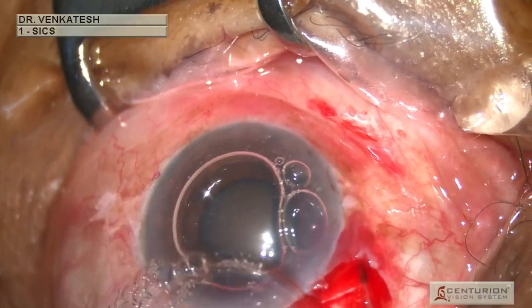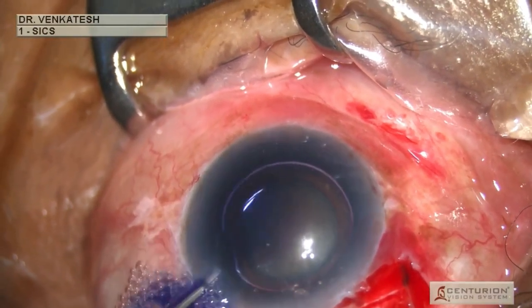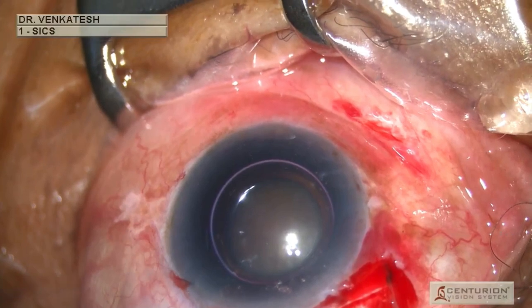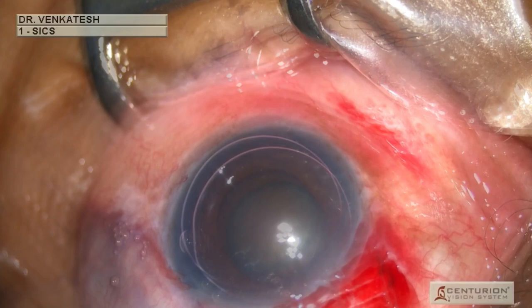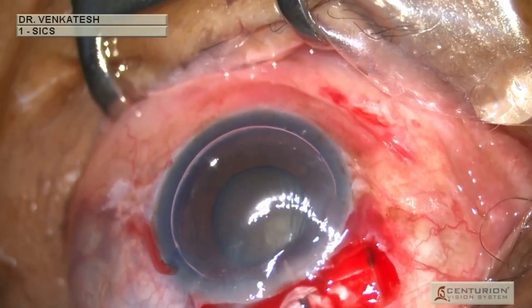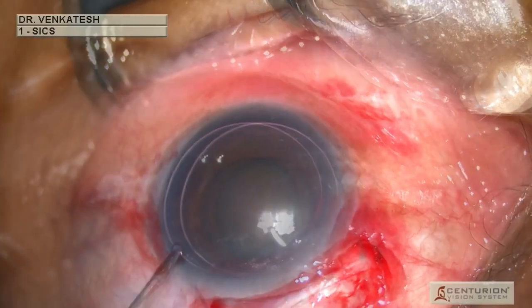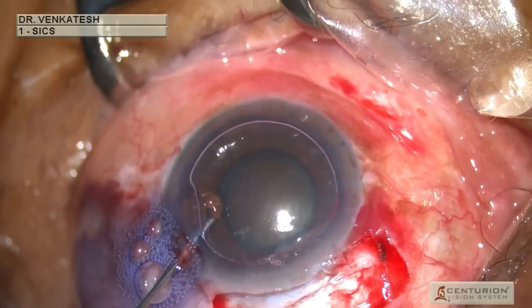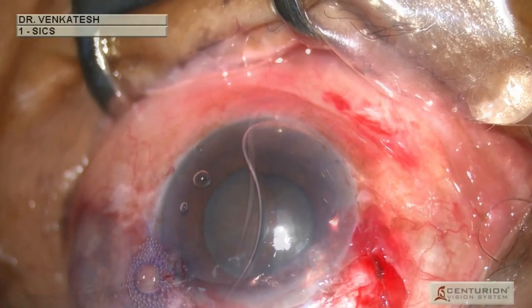An air bubble is then injected followed by trypan blue to paint the anterior lens capsule. An additional air bubble is injected to improve the trypan blue stain. Viscoelastic is injected between the two lips of the tunnel to facilitate smooth entry of the keratome, and then injected to form the anterior chamber, preventing its collapse during keratome entry.